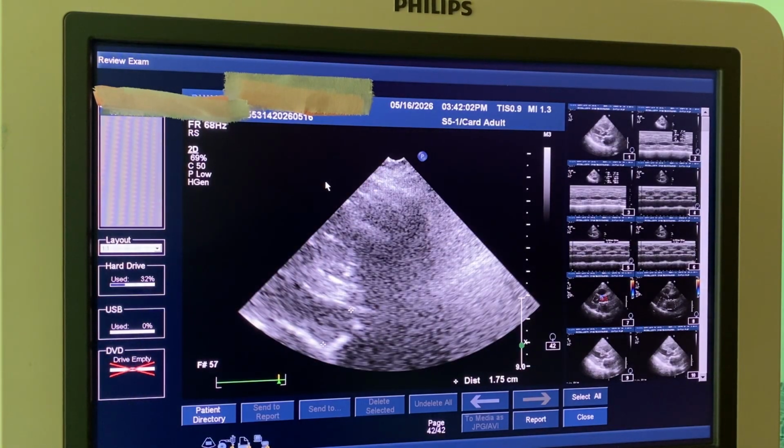Area of the circle is equal to pi r squared. You have the diameter, meaning it will be pi d squared over 4. You put it in the equation and you get the area.